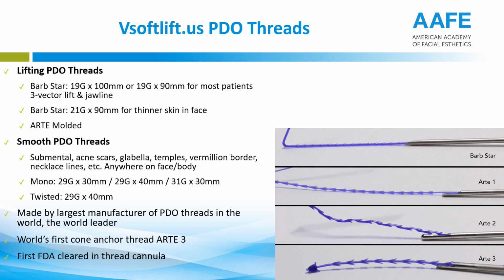Then there are molded threads. Now, the vSoft Lift line, the Barb Star, are approximately, in our testing and others as well, 20% stronger than all the other ones that are out there. Again, that pretty much relates to why you need more PDO threads with some of the others out there.